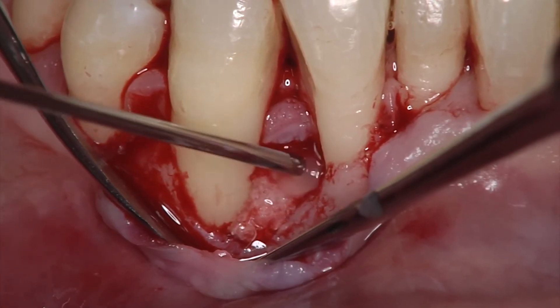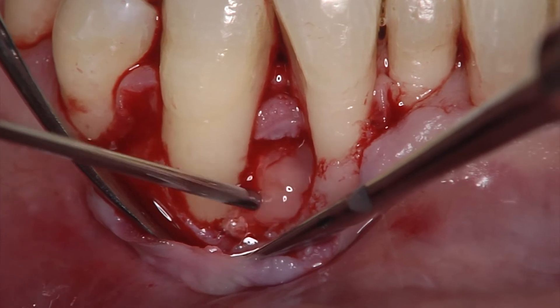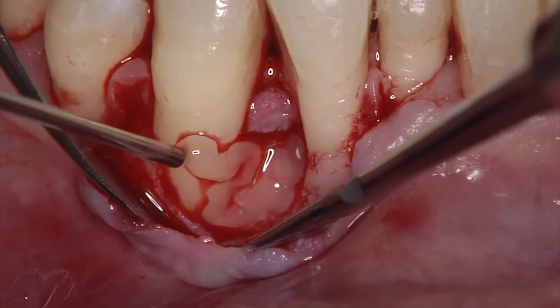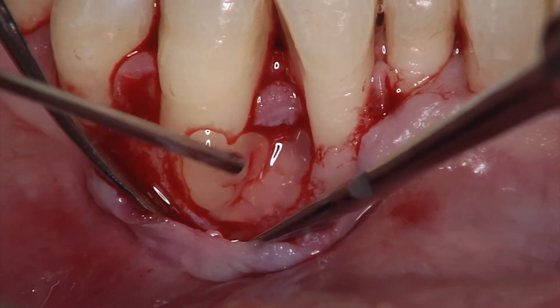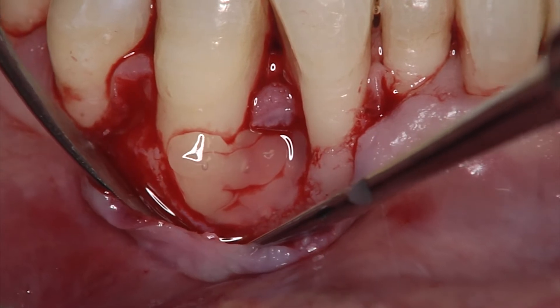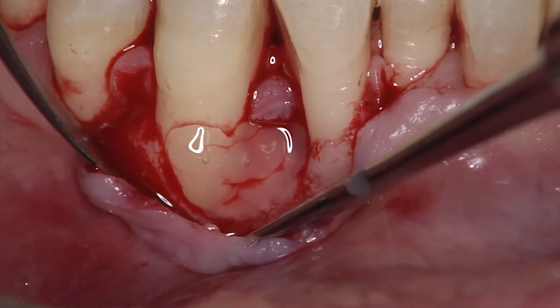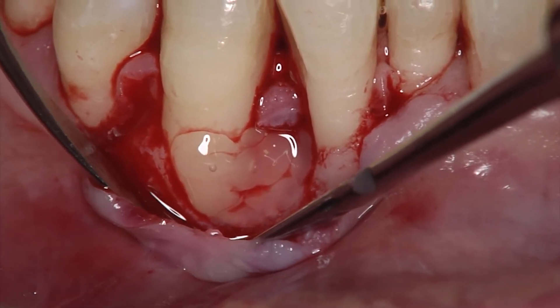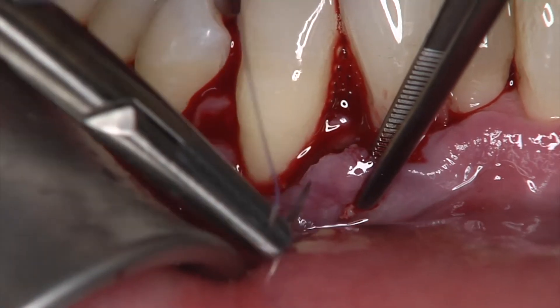A second layer of Straumann Emdogain is applied on the exposed root surface and on top of the bone substitute that will be in contact with the soft tissues of the repositioned flap.